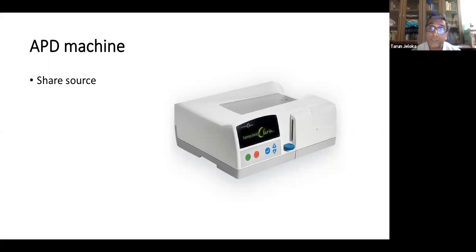So another is the number of exchanges you have to fill in. It will calculate the dwell time on its own. Something you should remember: the newer machine has Share Source. It is linked to the nephrologist's software. So even if the patient doesn't come to you, you can get the daily data from your computer using that software, because there is a wireless link. Somebody may ask, what is Share Source? That is what it is, because the data is linked to the nephrologist's software.